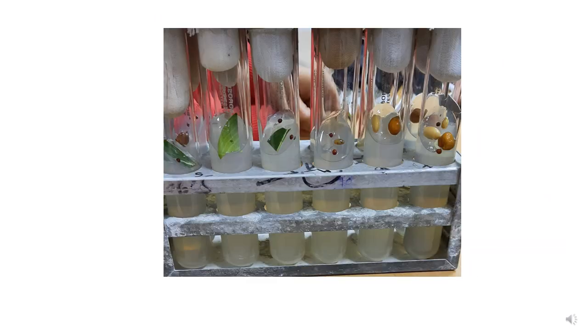Here in this picture you can see that these are tissue culture media which are poured in test tubes, and the explants have been cultured. There are different explants you can see. Some are seeds, some are leaf explants, and you can see that the media is poured in test tubes and the media is slanted to increase the surface area so that more explants can be cultured on the media.